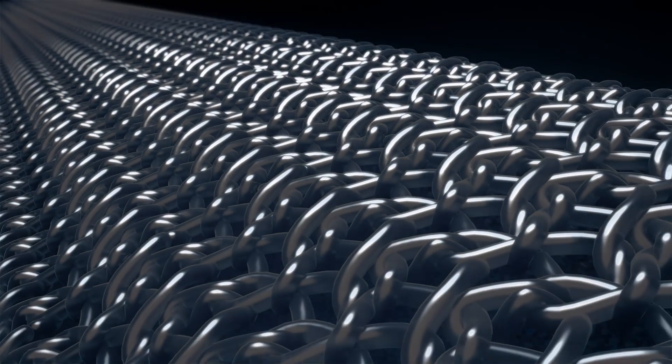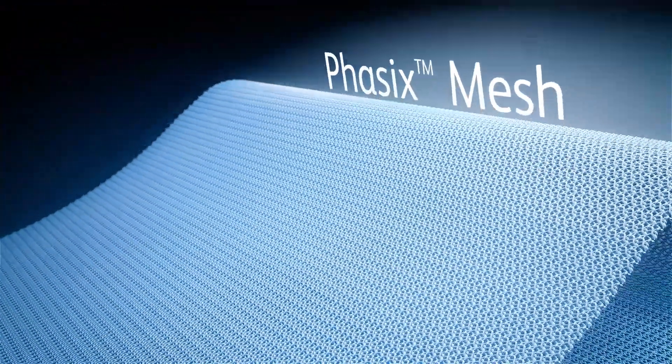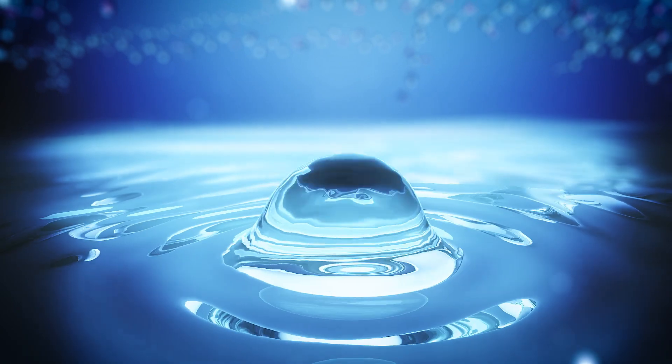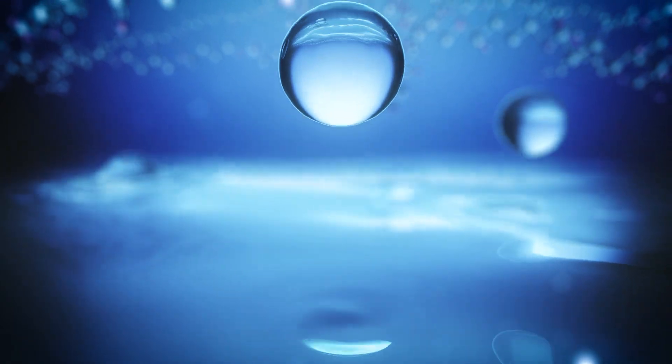Phasix is a fully resorbable monofilament scaffold for hernia repair — the only hernia scaffold produced through fermentation rather than chemical synthesis.